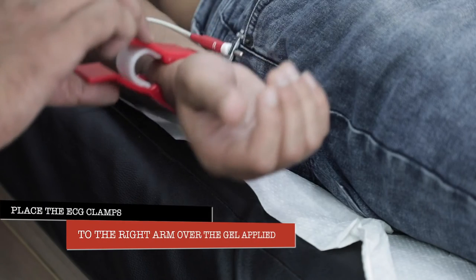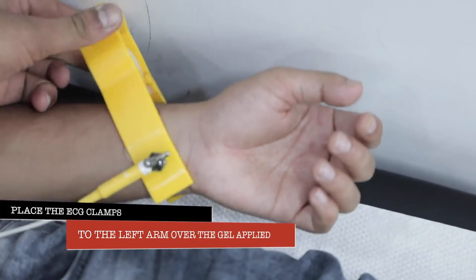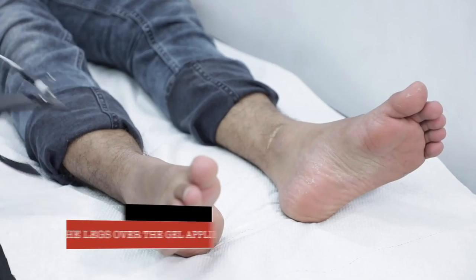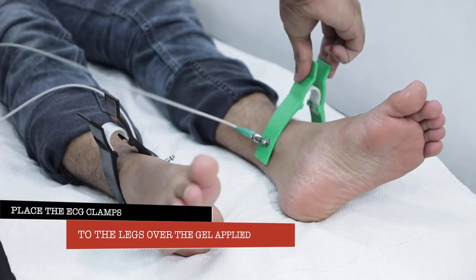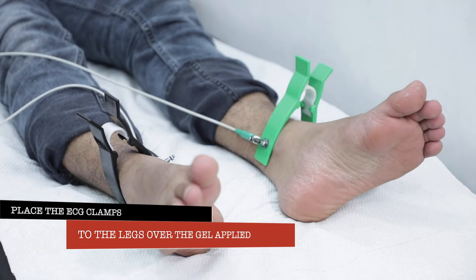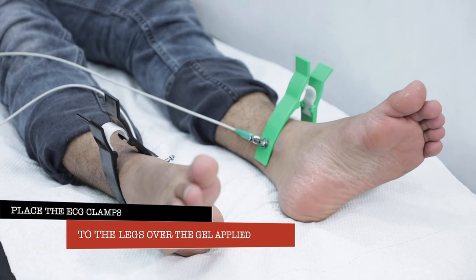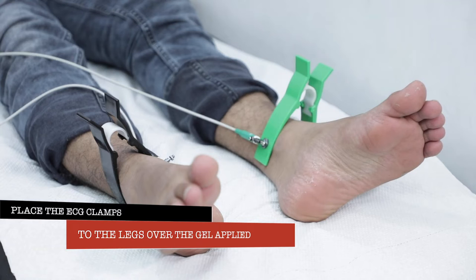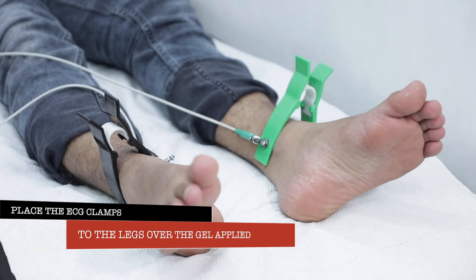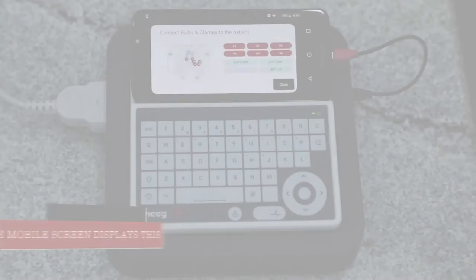The second component is the clamp electrodes. The reusable peripheral clamp electrodes for an ECG electrocardiograph have features that make them absolutely reliable during signal recording with all different ECG electrocardiograph devices on the market. The electrode metallic part is made of silver-coated material, allowing a safe and clear signal transmission. The peripheral electrodes, thanks to screw and clip connections, can be connected to all ECG electrocardiograph devices and monitors with patient cables that have plug or snap connections.